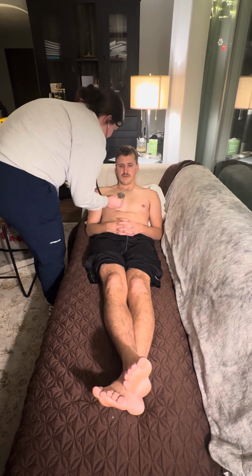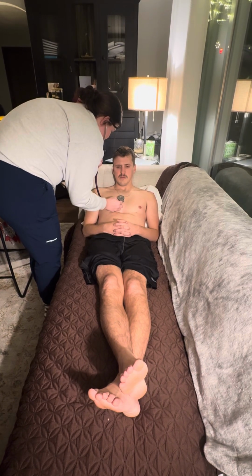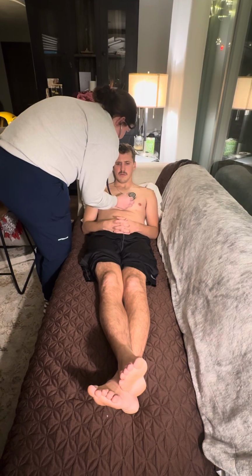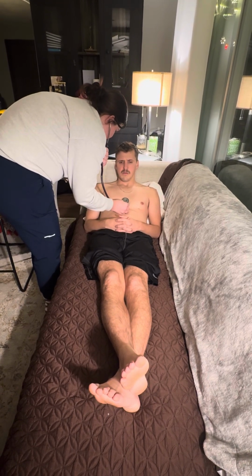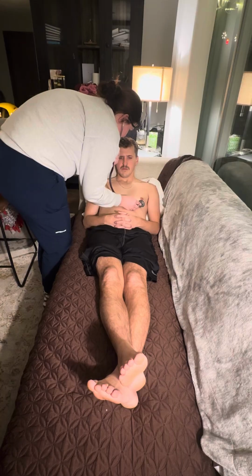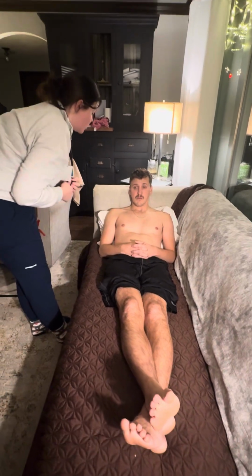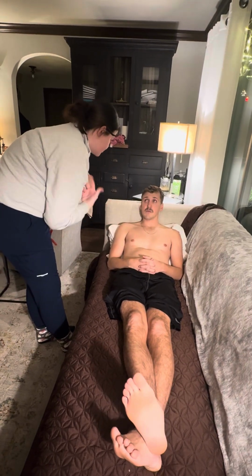And now I'm switching to the bell. I do hear those S1 and S2 sounds. No extra sounds are heard, like S3, S4, murmurs, clicks, or rubs.